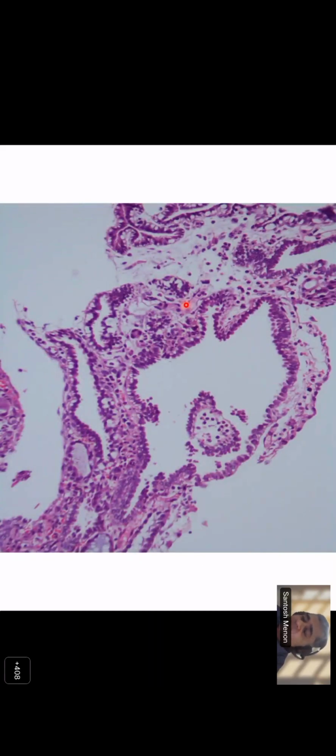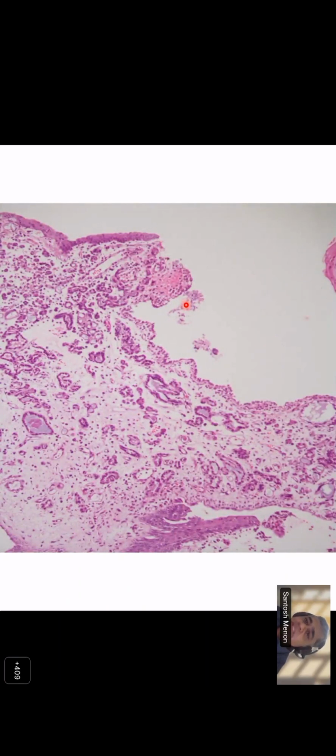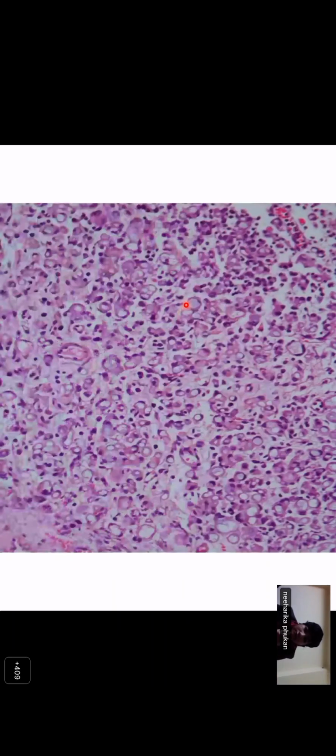You see, this is your clinching thing. This looks totally different. It looks very bland. There is no mitosis, no atypia, although it does look a little hobnailed. It does make you remember a clear cell adenocarcinoma of the ovary, or clear cell adenocarcinoma in general in the urogenital system. But there is no atypia, there is no mitosis, and these are accompanied by very bland-looking tubules. So this is not an uncommon tumor in the urogenital tract, nephrogenic adenoma, but there is a little different morphology.